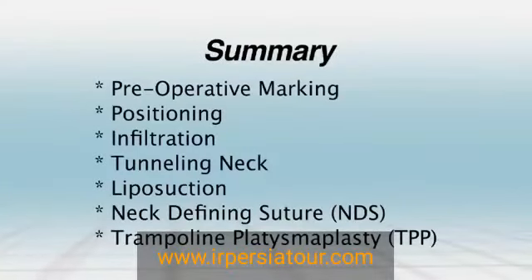This summarizes the preoperative marking, positioning, infiltration of the neck, tunneling of the neck, and liposuction in this patient, as well as placement of the neck defining suture and trampoline platysmoplasty.